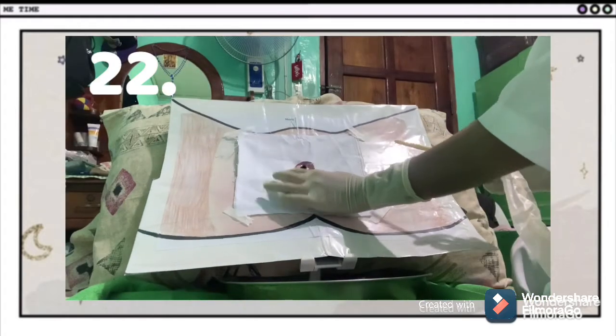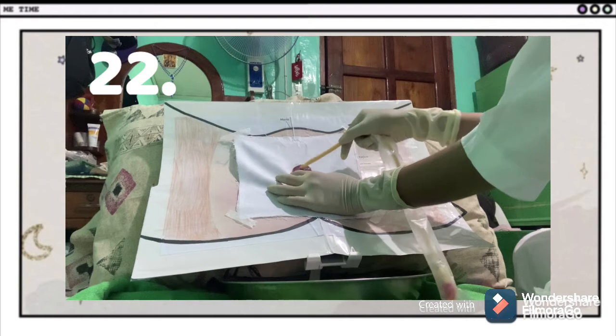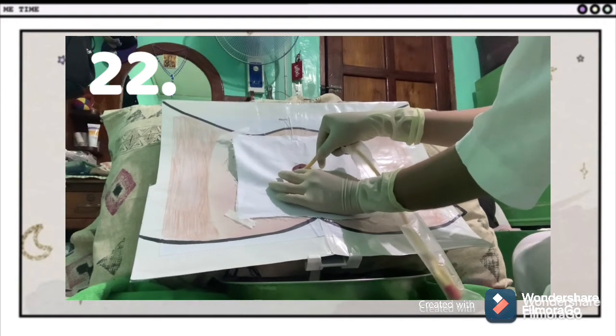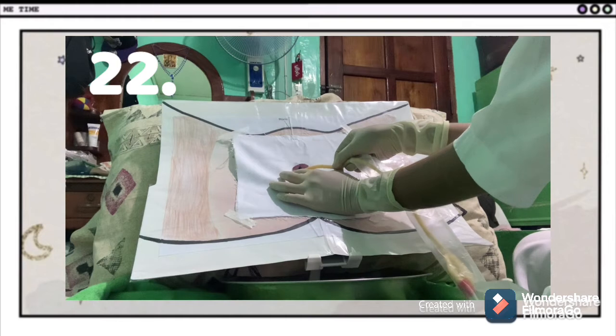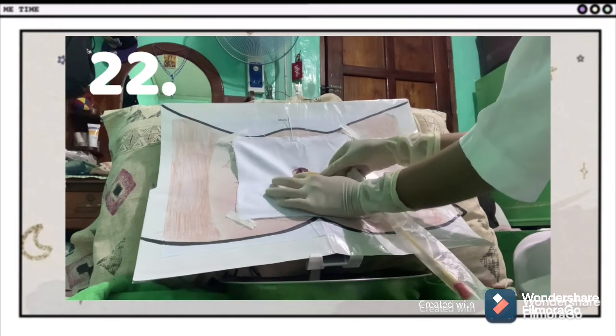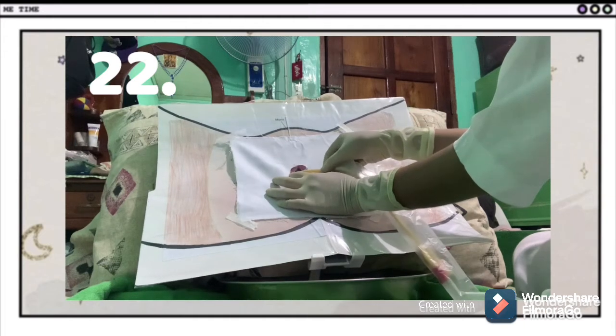Insert the tip of the catheter into the dimple-like structure below the clitoris, which is the meatus, about 2 to 3 inches or until urine flows. Do not force the catheter through the urethra. Ask the client to breathe deeply and rotate the catheter gently if slight resistance is met. Take a deep breath, ma'am. The sphincter relaxes and the catheter can enter the bladder easily when the client relaxes.